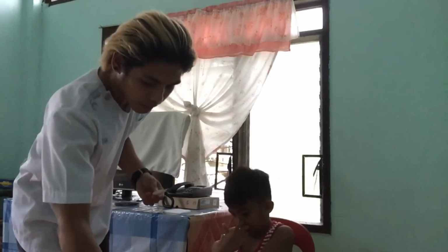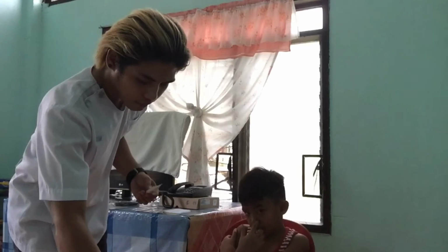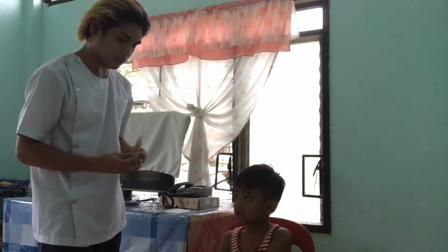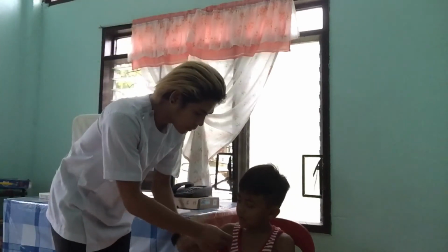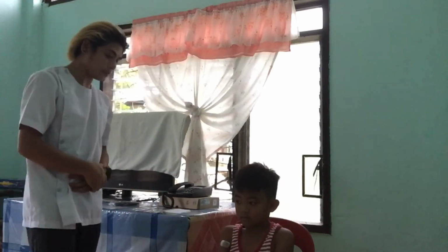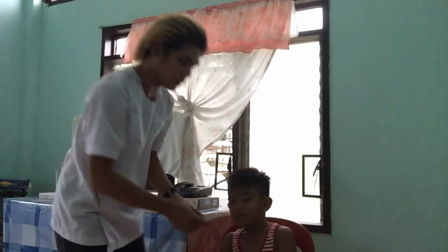Assessing for body temperature. Select the most appropriate site for the measurement. Wipe with cotton ball from cleanest to dirtiest. Then place the thermometer. Wait for the appropriate amount of time and remove the thermometer. Wipe with a wet cotton ball from cleanest to dirtiest. Read the temperature at eye level.